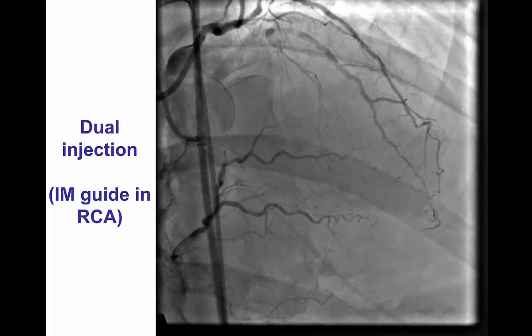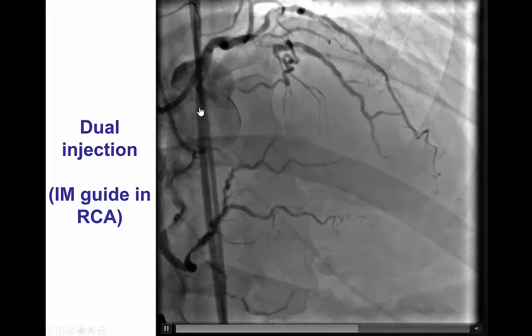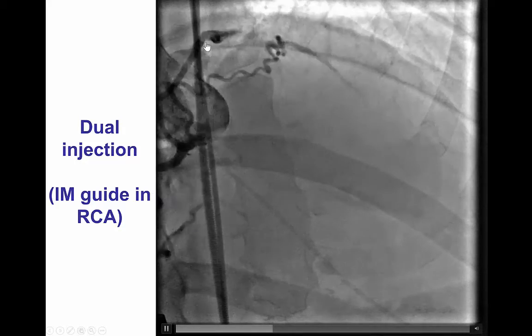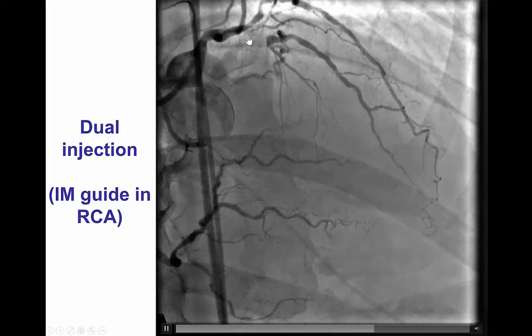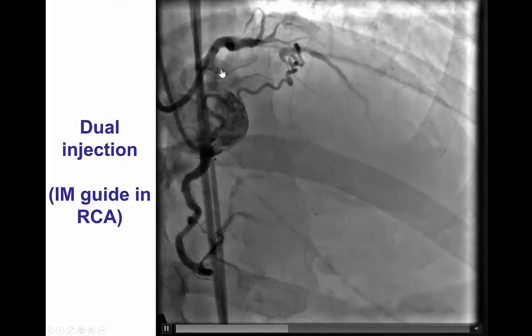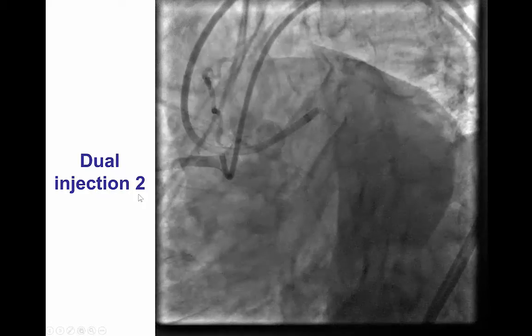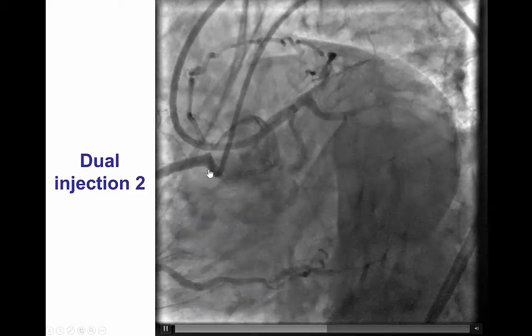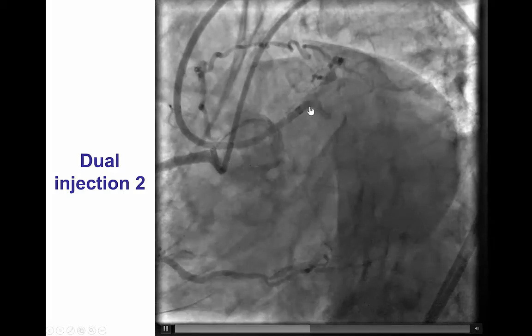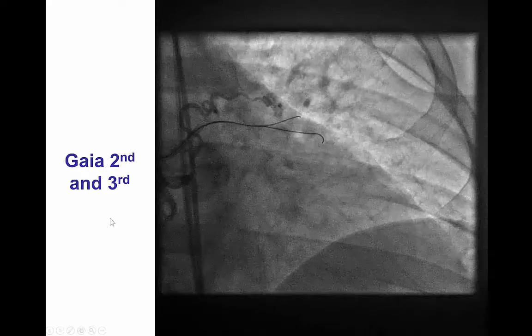We now performed a dual injection during attempts to recanalize this lesion, achieving better filling given the larger size of the guide catheters. Now we can see the anticipated course of the LAD, although the proximal cap does remain blunt, making it a little harder to enter into the occlusion. Here is the dual injection in the caudal view demonstrating a potential course of the vessel, but still there is no nub and there is ambiguity in the proximal cap.